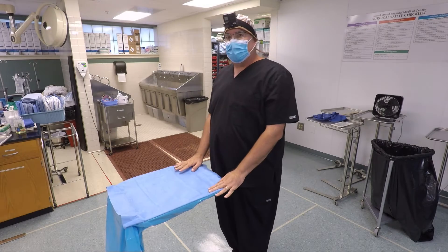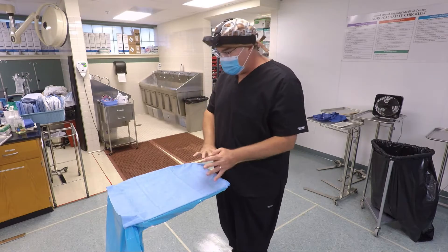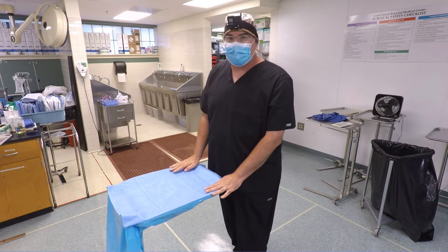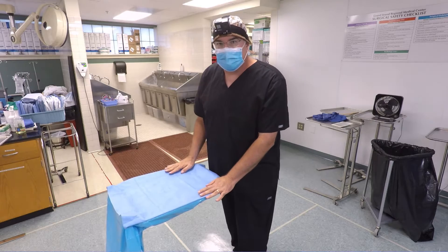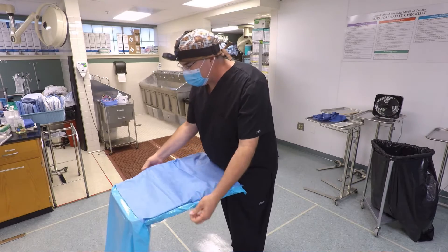This is the way I refold a Mayo stand cover. This is not something you're going to do in clinical sites — you are always going to throw your Mayo stand cover away — but this is the way I'm going to refold it so that we can reuse it here in the lab. I like to do it on the Mayo stand itself, so the first thing I'm going to do is pull it out from being tucked under the tray.